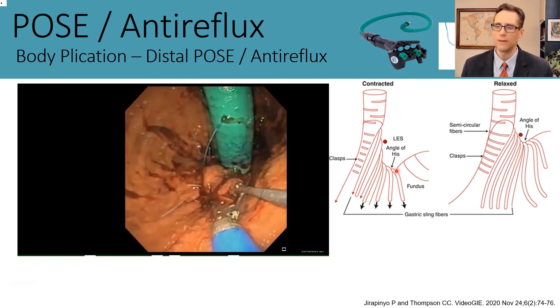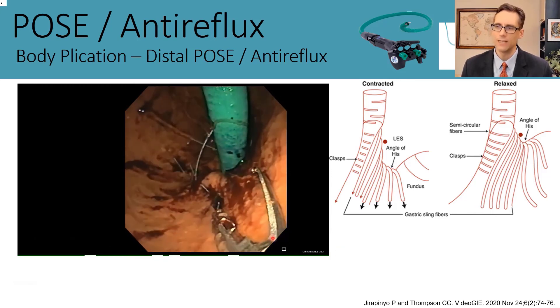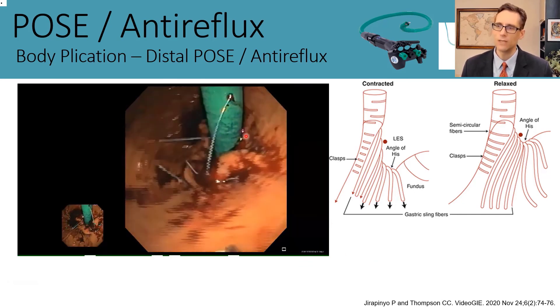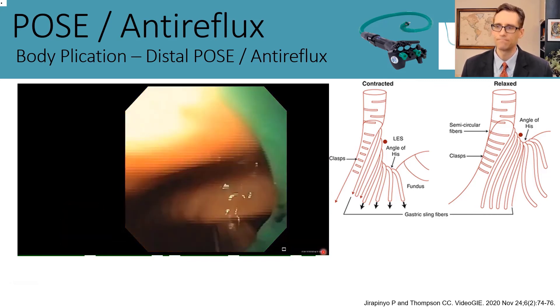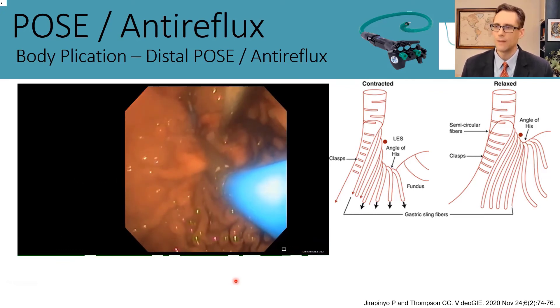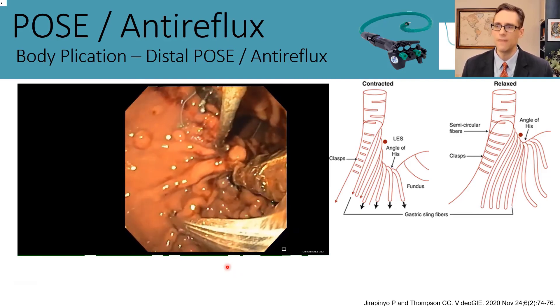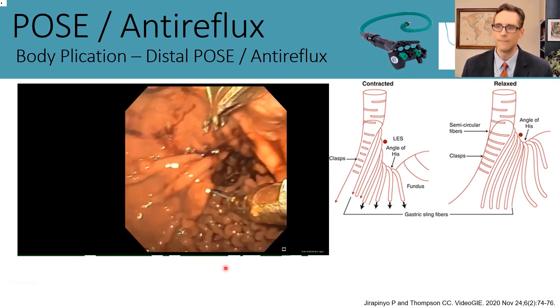We work on pulling down those sling fibers and tightening the clasp fibers, then shoot a crossed plication creating some narrowing at the LES as well. It looks substantially different after several plications are placed. We then perform the typical distal POSE procedure, forming a distal belt initially and then running the suspender plications as well.